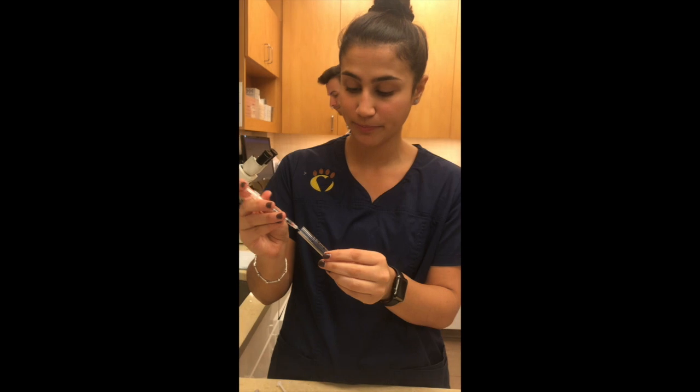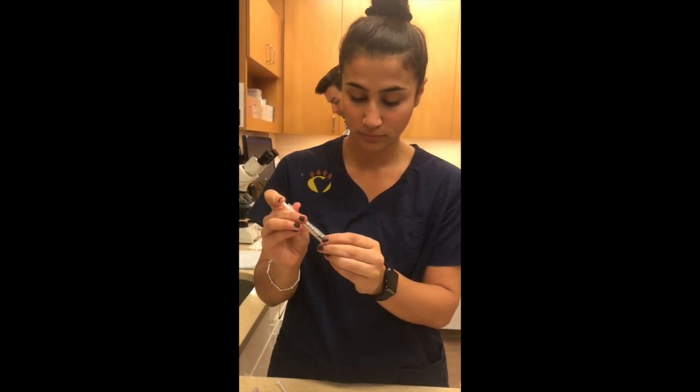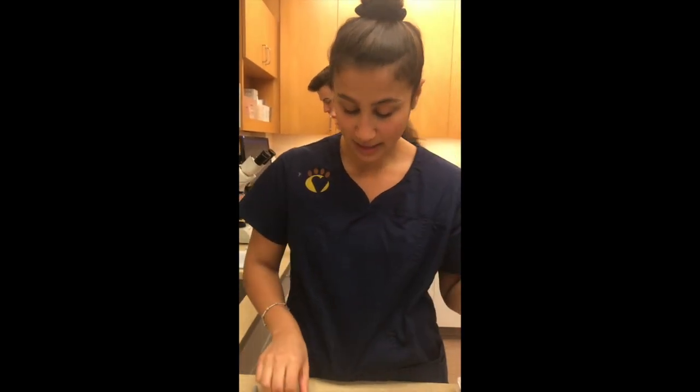Now I'm going to add this to our donor tube. And then I'm gonna add 0.98 mils of saline in this tube.